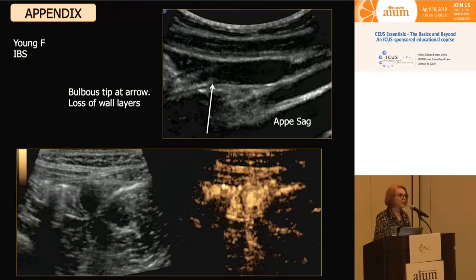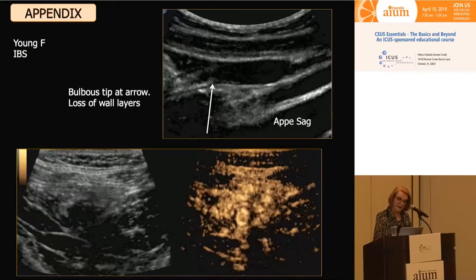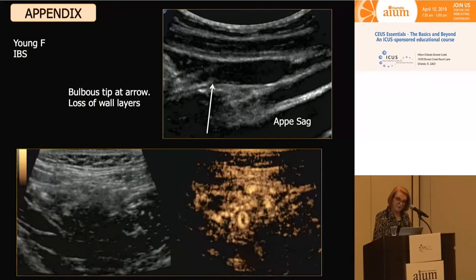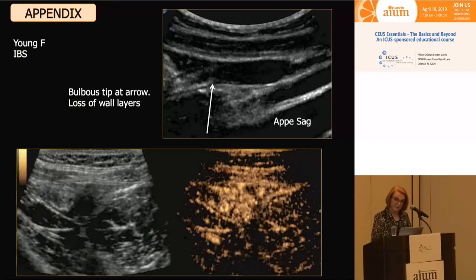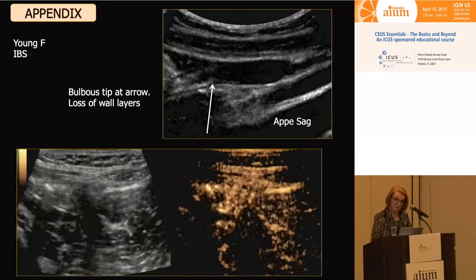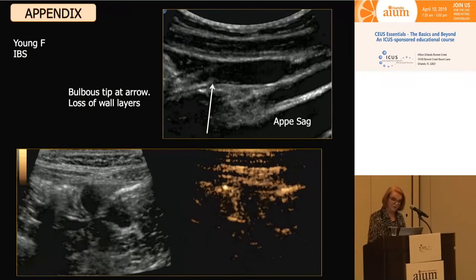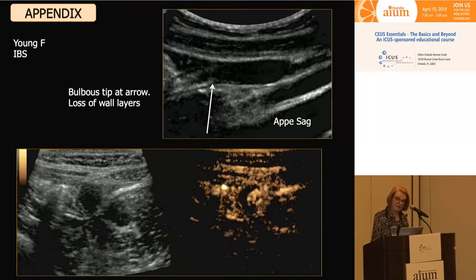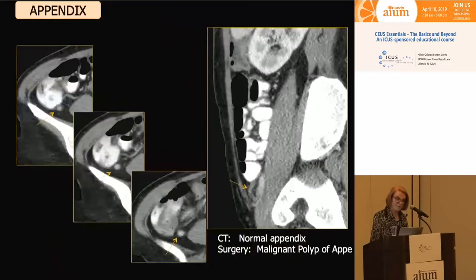Looking in axial view when we inject the contrast, there is in fact a finger-like polypoid tumor growing in that appendix. Looking at the black appendix, when we inject the contrast, there's a finger-like polypoid mass that's hypervascular. We took many more pictures — it was indisputable. There was a mass in there, so we reported it as a polyp in the appendix, which we thought was potentially malignant.